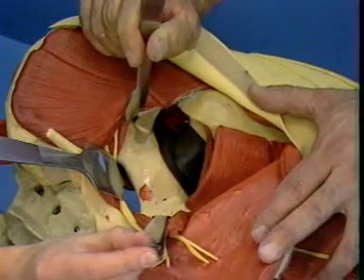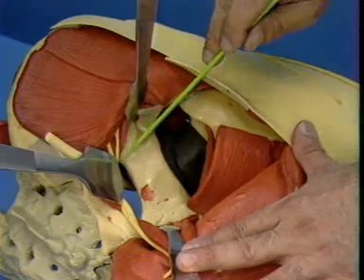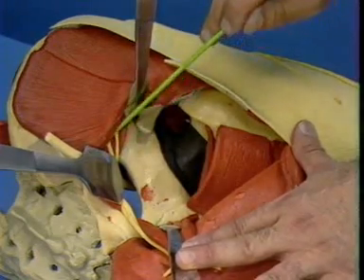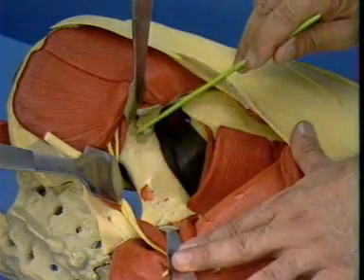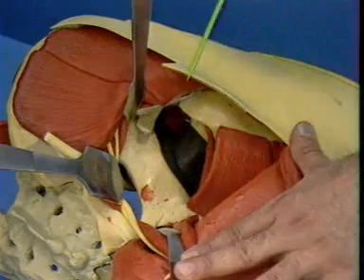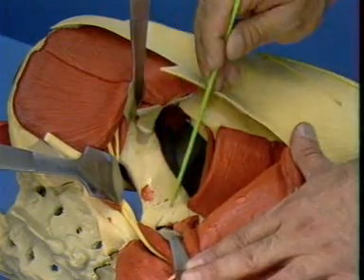A Hohmann retractor can be placed with the tip driven into the inferior iliac wing. Care should be taken not to stretch the superior gluteal nerve. The entire retroacetabular surface is now exposed, from the superior portion of the ischial tuberosity to the inferior ilium.